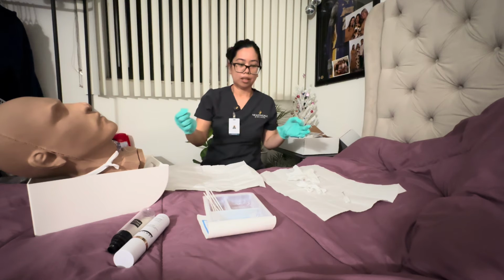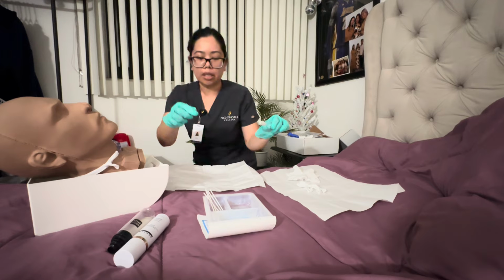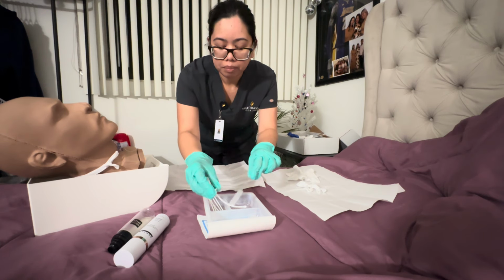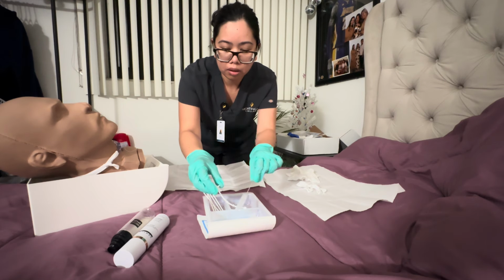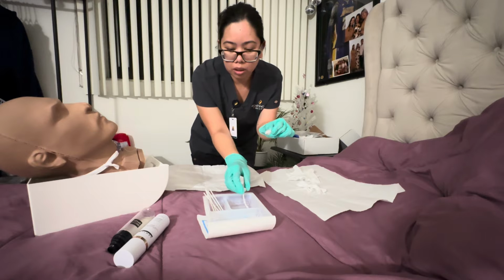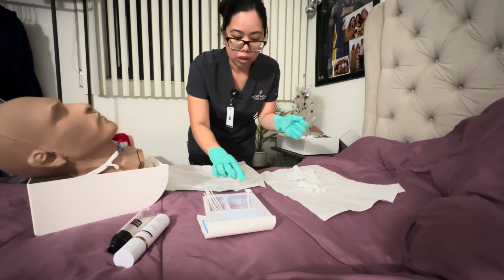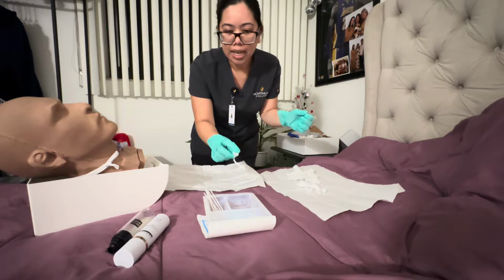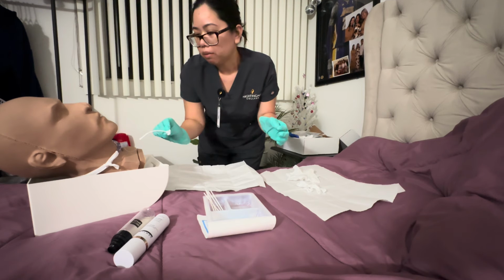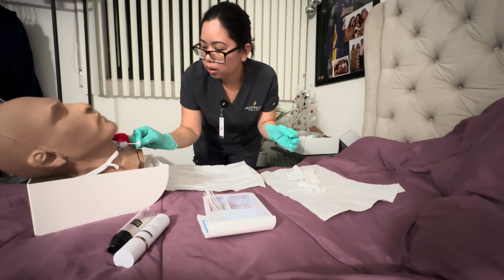Okay, and then what we're gonna do is we're gonna put it in the soaking solution with the hydrogen peroxide mixture. We're gonna go ahead and grab our brush and clean it up of the secretions and crust. Okay, after that, we're gonna rinse it in normal saline over here. We're gonna discard this brush. Okay, after we rinse it and it's all dried up, we're gonna be putting it back. Be careful.